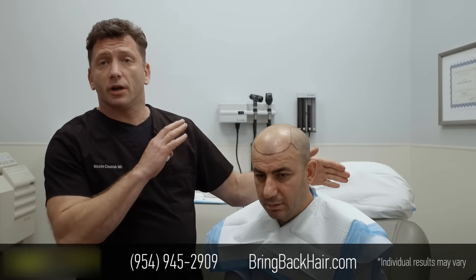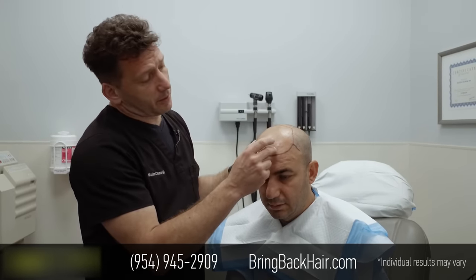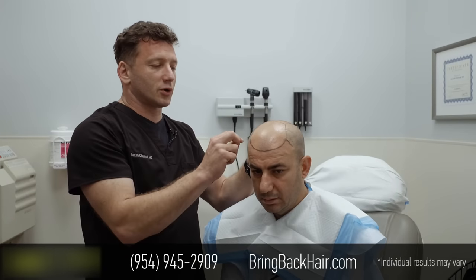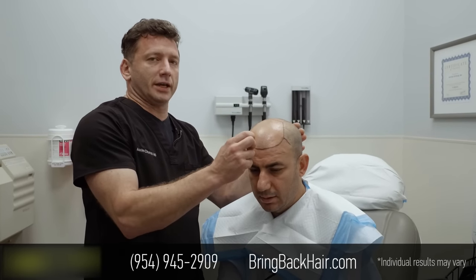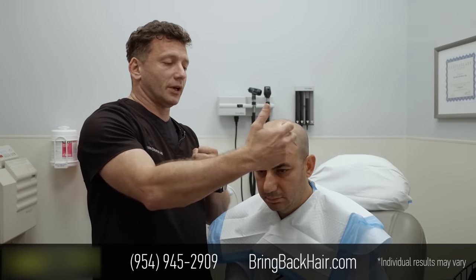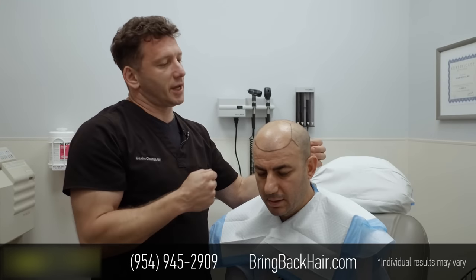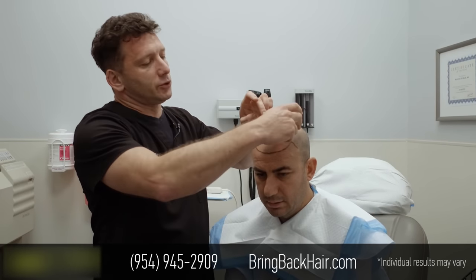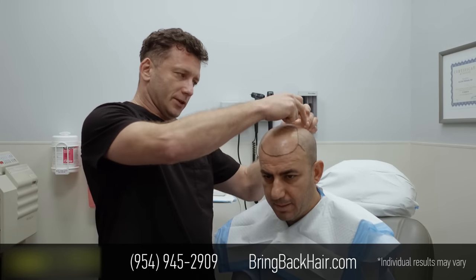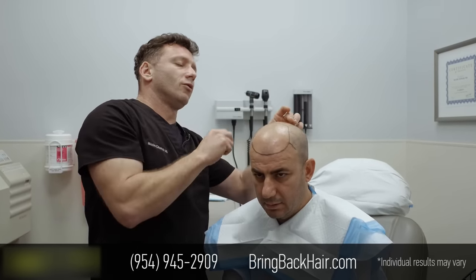We just finished the first part of creating the hairline. I followed the remnants of the hair anteriorly, and I want to make sure everything is symmetric. The actual hairline will be zigzagging. With the robot, we have the ability to make it look natural. The site-making part will be done with the robot, while the occipital and vortex areas will be done manually.